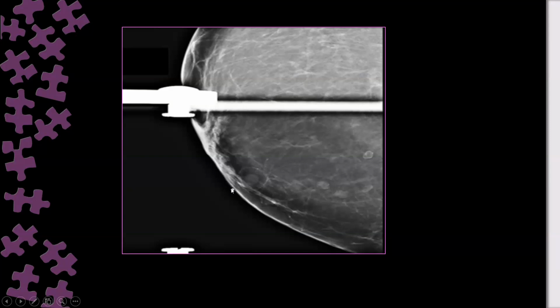Imagine that this is a mole in the skin. Imagine this BB as a mole. So what is this view? And here you can see the mole sharply, well defined like this. Skin magnification view.